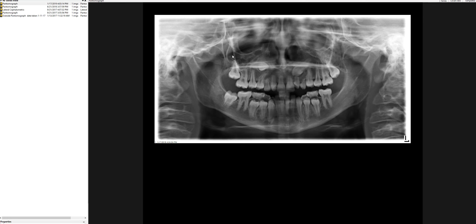Hi everyone, welcome to my second radiograph of the day. This case again came in today from the orthodontic department. Why don't you take a minute to look at this panoramic radiograph and let me know what your thoughts are? Take a look and tell me what you see.